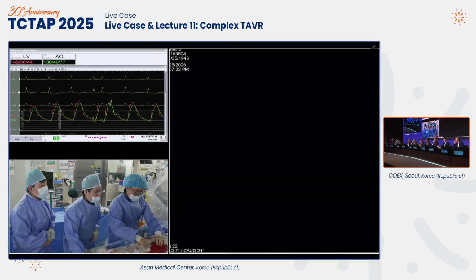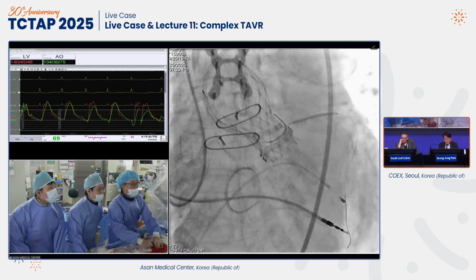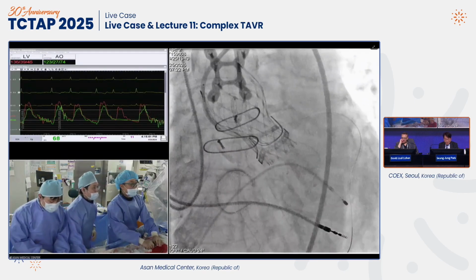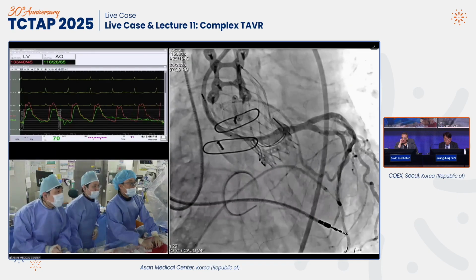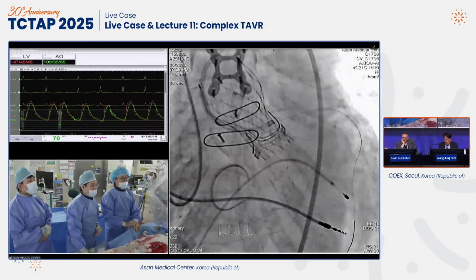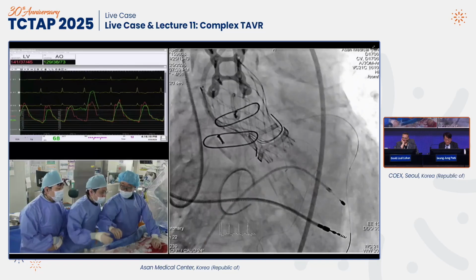And then we'll pull this stent out and take another shot. Are you in the ostium? There is absolutely no limitation. Let's shoot from here. Okay, test. Okay. Let's shoot here. Back and forth, pull back a bit. Okay. Angio. Push shot. Nice. Yeah, yeah. It almost looks bigger than it did on the pre-op. Yeah. So I think the coronary flow is okay, and the hemodynamics are okay. I think this is the best result we can achieve.